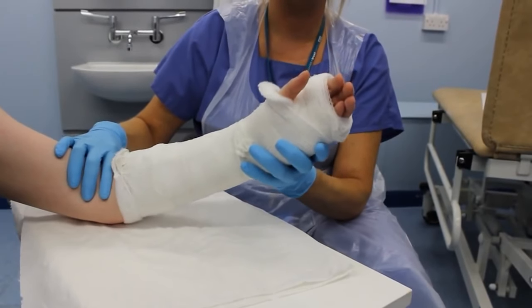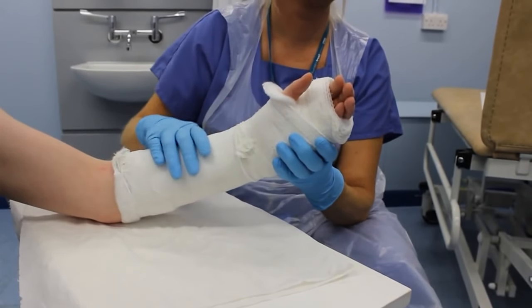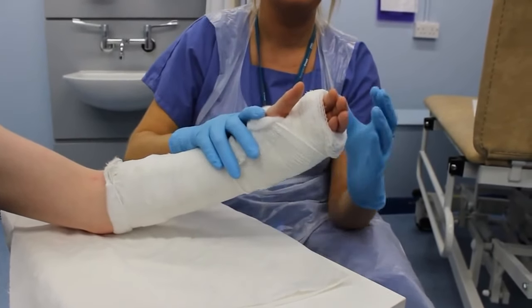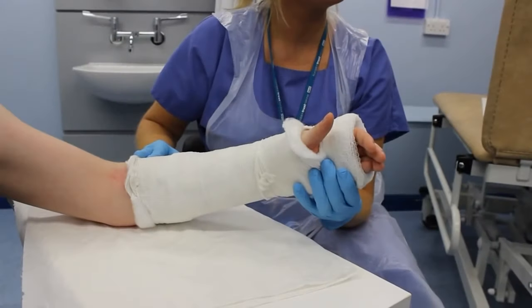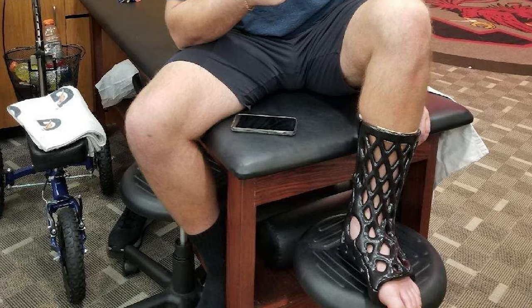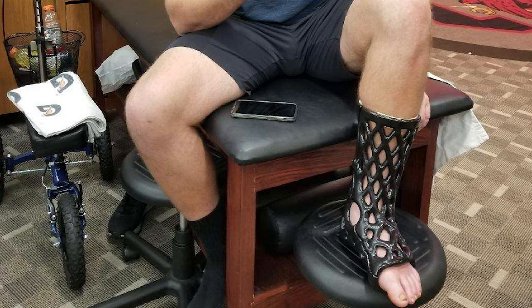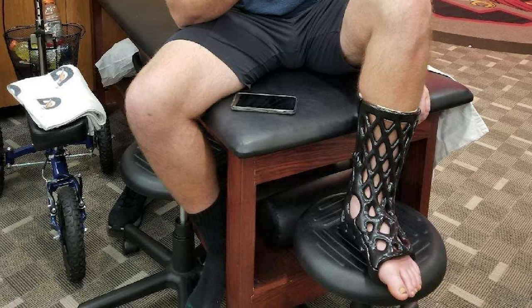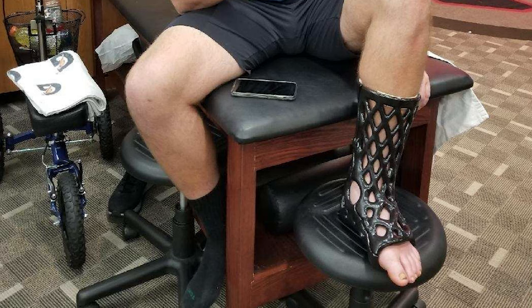Another disadvantage of conventional gypsum casts is the inability to properly distribute pressure. This is perhaps the biggest disadvantage as it slows down the healing process. Coming to 3D printed orthopedic casts, these casts are custom made and their lattice structure can be designed to add strength to specific areas that need support and to relieve pressure elsewhere.